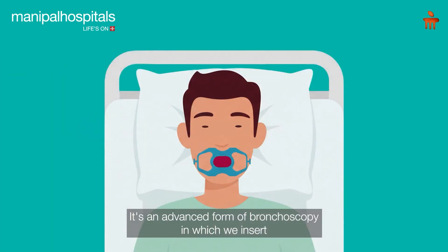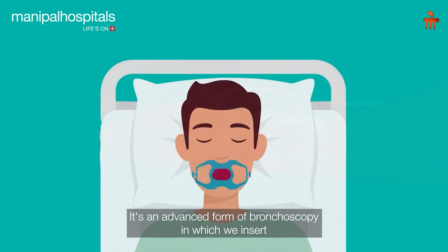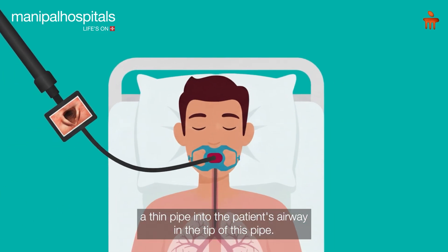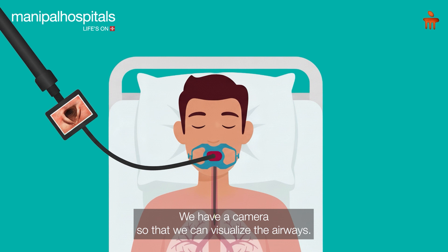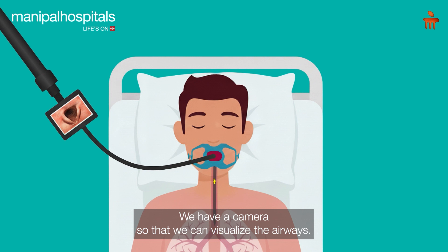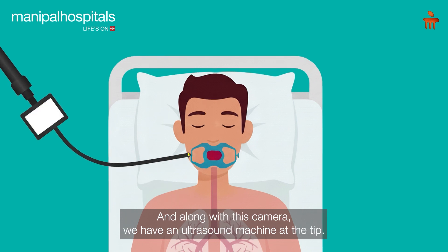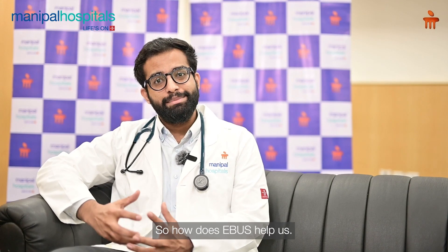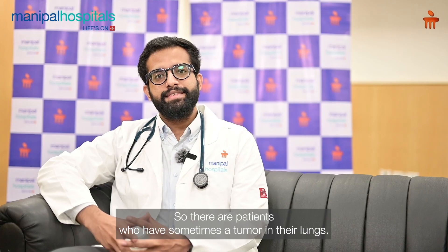In EBUS, we insert a thin pipe into the patient's airway. At the tip of this pipe we have a camera so that we can visualize the airways, and along with this camera we have an ultrasound machine at the tip.